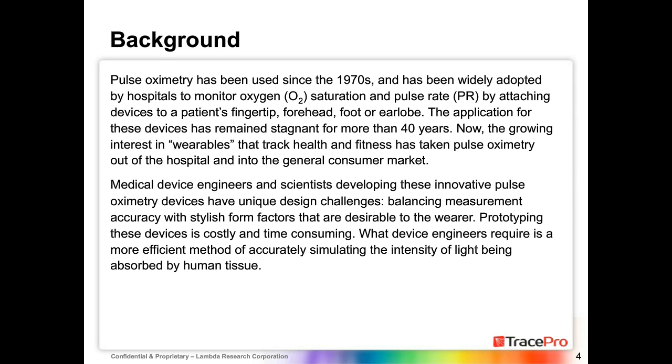We're talking about balancing measurement accuracy with providing a stylish form factor. For instance, how the wearable looks on someone's wrist, and are we talking something like an Apple type of scenario, or something by ASUS or another vendor? Prototyping these types of devices is costly. It's time consuming. And you have to do it for a great deal of different types of people.